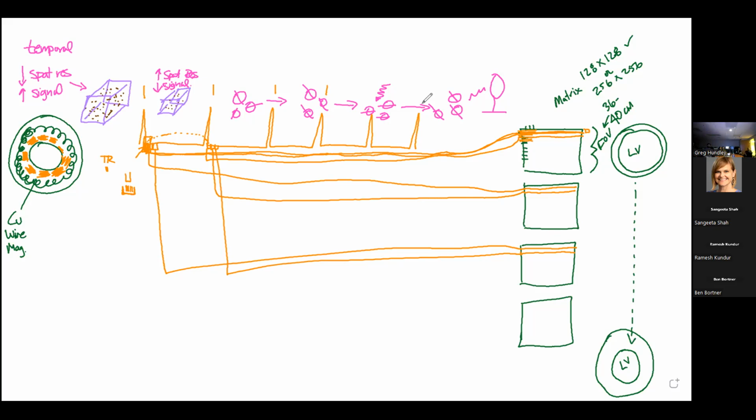I'm going to take this QRS window here and bring you down here. We've got our multiple lines here, and then the next beat is multiple lines here, the next interval of time. We can actually share information from some of these from the first interval of time and the second, and create an intermediate interval called view sharing. And we can populate these frames even quicker.